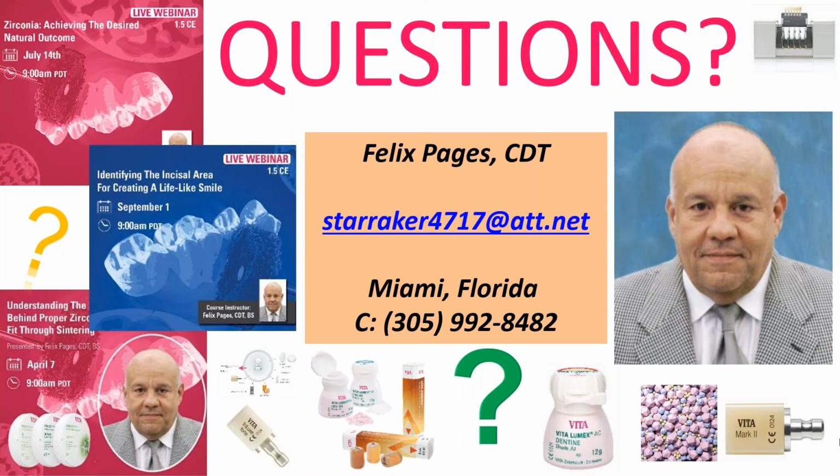Now that we have different pucks in the value ranges, so if you have 1M1, 2M1, 3M1, 4M1, okay? If my target's a 2M1, I'll go to either a 3M1 or a 4M1 and mill it out. So that area is lower value already, and then I can use a lighter dentine up top. So there's more than one way to skin a cat there. I'd rather have the color or lower value before I start. You just have to know what area is going to stick out.